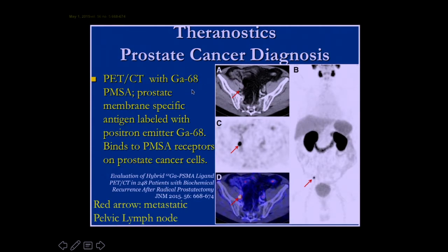So gallium-68 is a positron emitter. And it happens to have a 68-minute half-life. Great for testing. And it comes from a gallium-68 germanium generator. I should say a germanium gallium generator. So I order one of these and I put it in my lab and it hangs out for a month and I can label things.